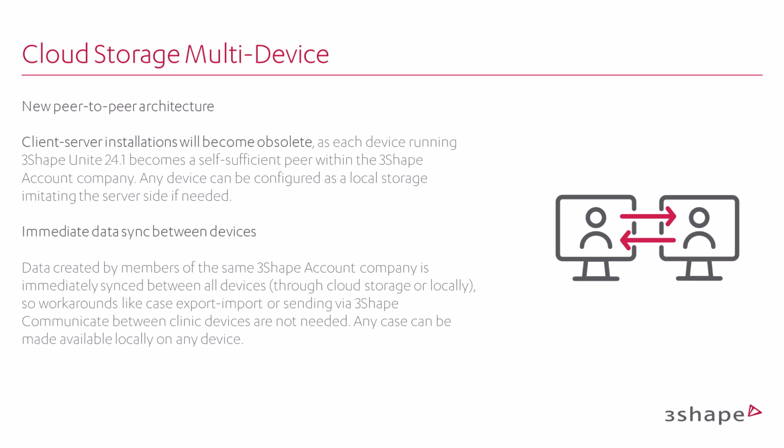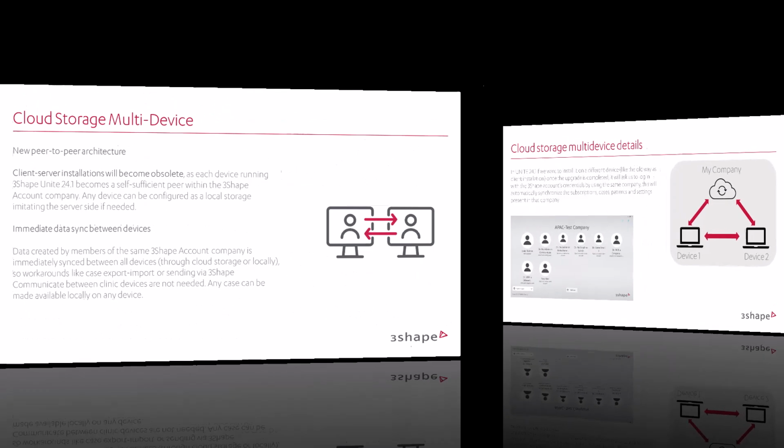Immediate data sync between devices. Data generated by members of the same 3Shape account company is promptly synchronized across all devices, whether through cloud storage or locally. This eliminates the need for workarounds like case export-import or sending via 3Shape Communicate between clinic devices. Now, any case can be made available locally on any device.